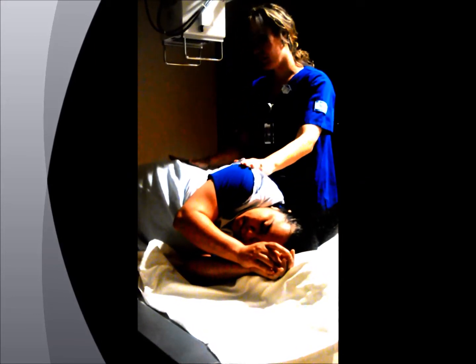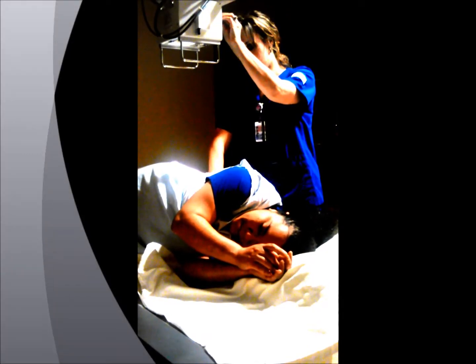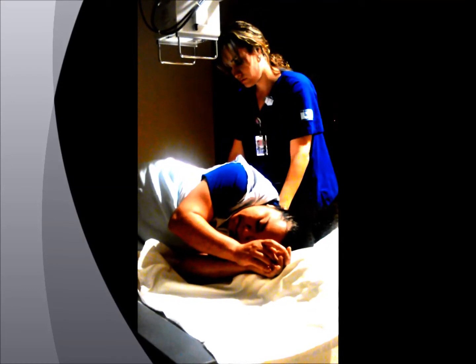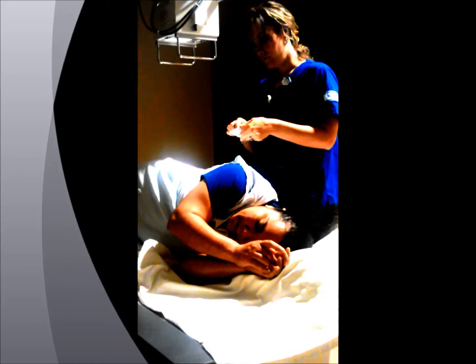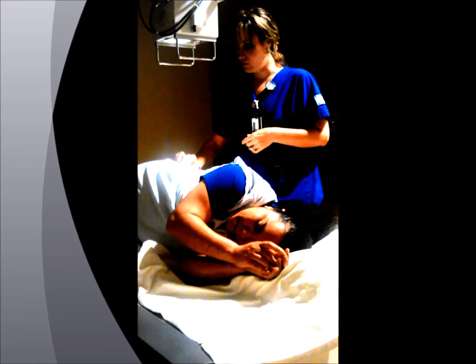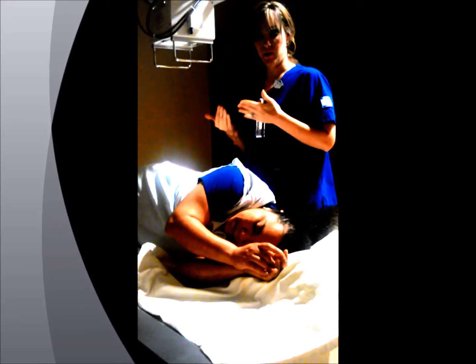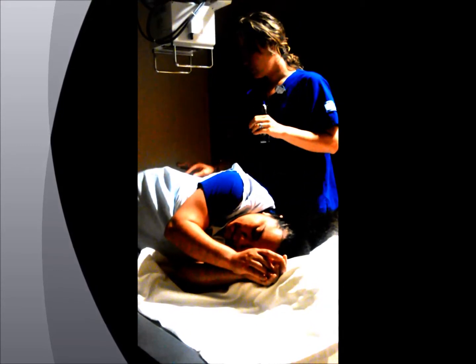Again, just make sure that the hips and the shoulder are in line. Light is just kind of skimming the back. Bring it back a little bit right here. And then go ahead and mark your side of interest, here, just kind of out of the way. You're going to suspend on expiration. Have your patient take a breath in, let it out, hold their breath, and expose.